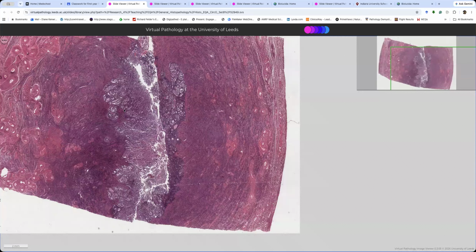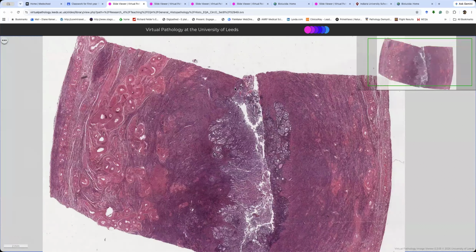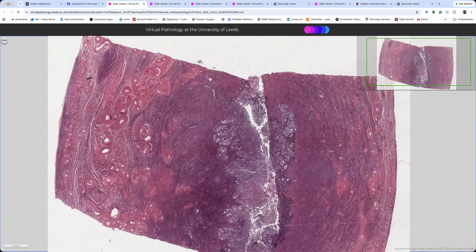Right? So this is the thickness of the wall, and then you measure the distance of the cancer to the outside. So this one here, we fortunately have a bit of benign over here. So I would say this is like 20 millimeters, and it is extending 18 millimeters from here to here. So it is 2 millimeters invasion. We do the sum. It's really hard, particularly in the bigger cancers, to work out where the endometrium begins and ends. But I'm going to tell you a trick.